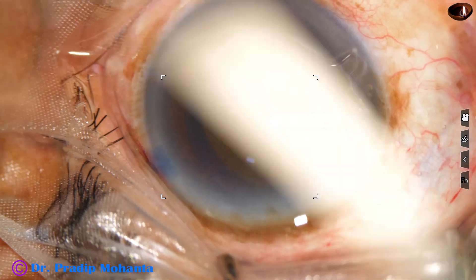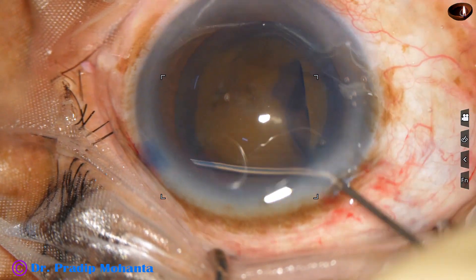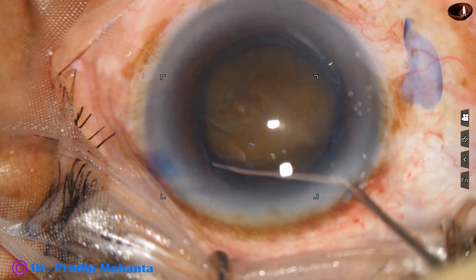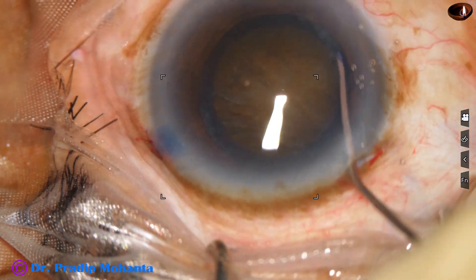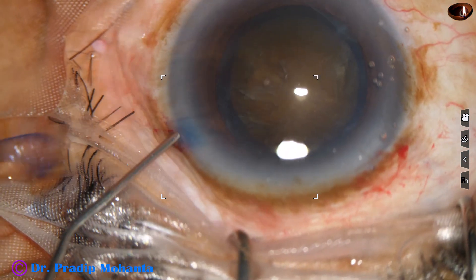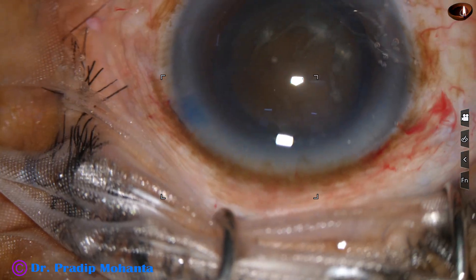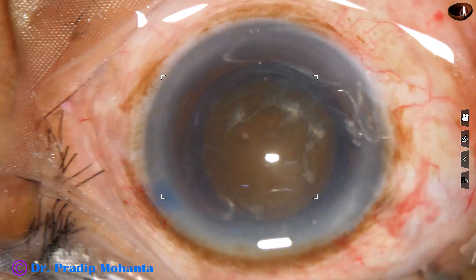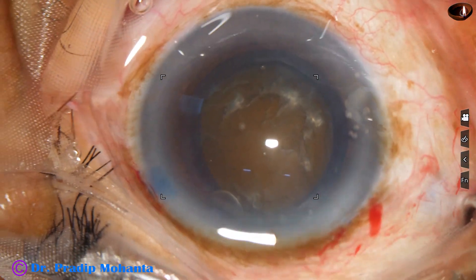Rhexis is done and now hydrodissection. A 27-gauge cannula is used. Small aliquots of BSS are injected at multiple points and the nucleus is gently balloted. An attempt is made to rotate the nucleus and we find that it rotates easily.